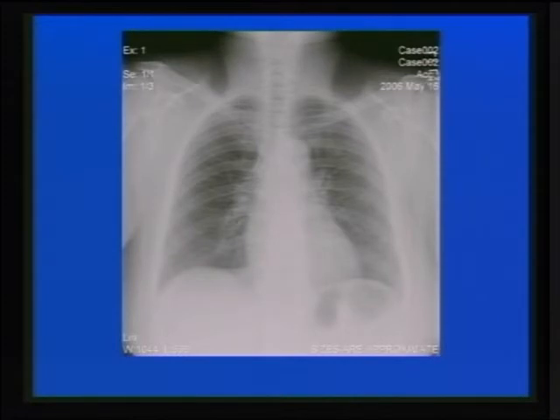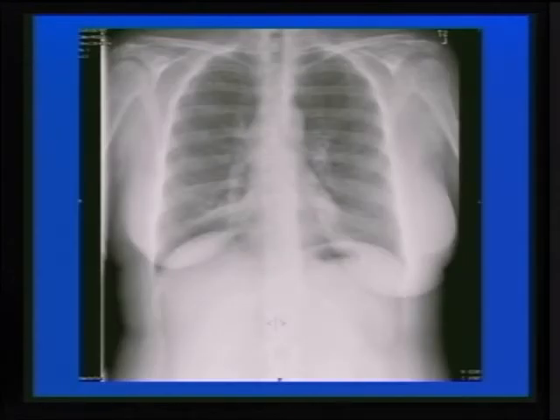Where? Right upper lobe, left lower. Much more obvious now that you remove the ribs. This is an actual case that I have with this technology. How about here?